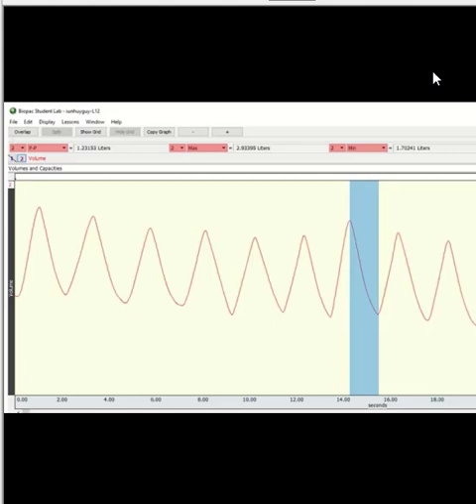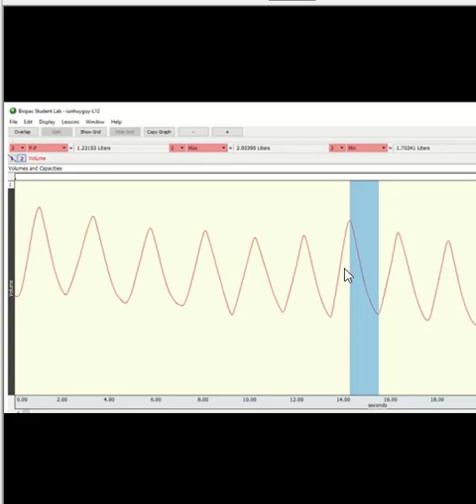Here's the same guy after a lot of exercise. His tidal volume is now 1.2 liters — up from 0.7 liters — so he's getting considerably more air with each breath. Looking at the 15-second mark, you count 7 breaths. Multiply by 4 — because 4 × 15 = 60 seconds — and that's how many times this person is breathing per minute, obviously a lot more than the resting 12.